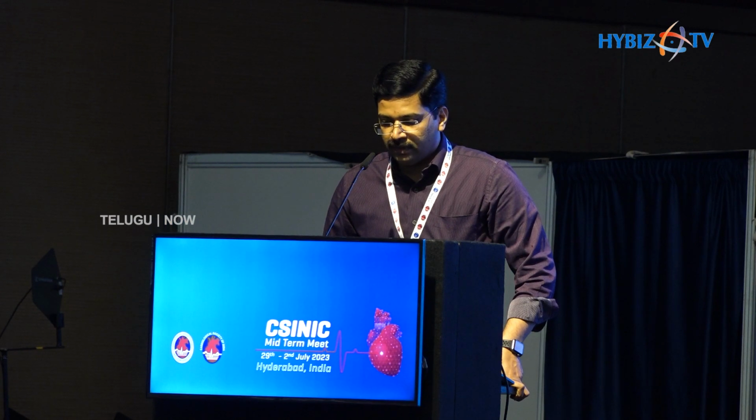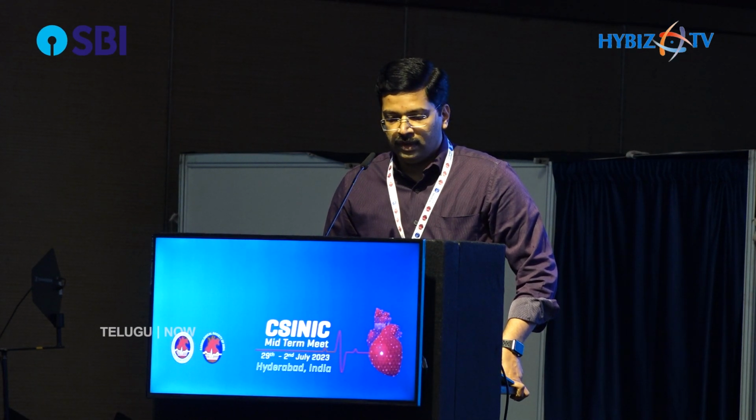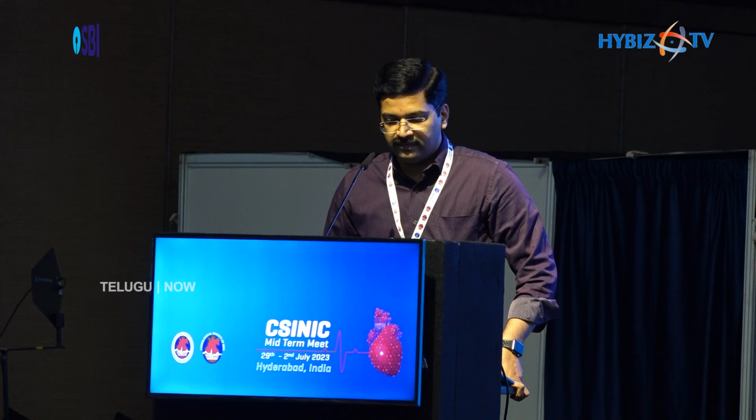Coming to the length of the lesion, from the ostium of the LM up to the septal branch, it was 36 millimeters. So we planned to use a 38 millimeter stent so as to flare the ostium of the LMCA. And from the septal branch up to the distal reference, it was 25 millimeters. So we thought of using a 28 millimeter stent for the overlap. We predilated the LAD with a 2.5 NC balloon followed by a 3 millimeter cutting balloon. Then we took an IVUS run from the LCX.